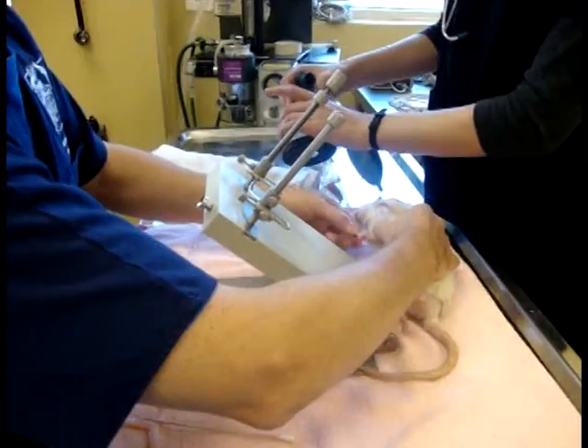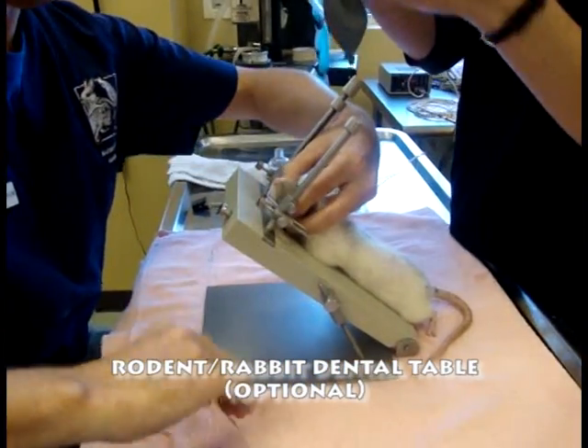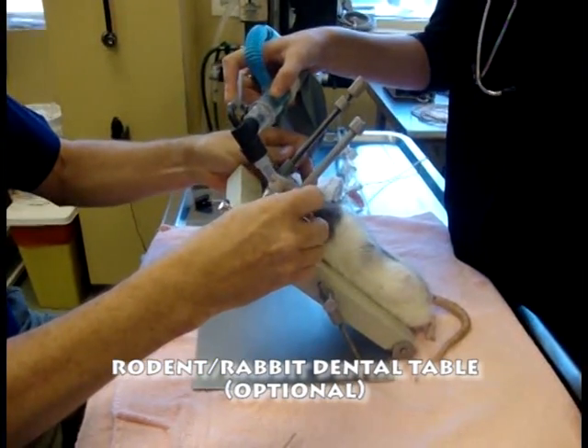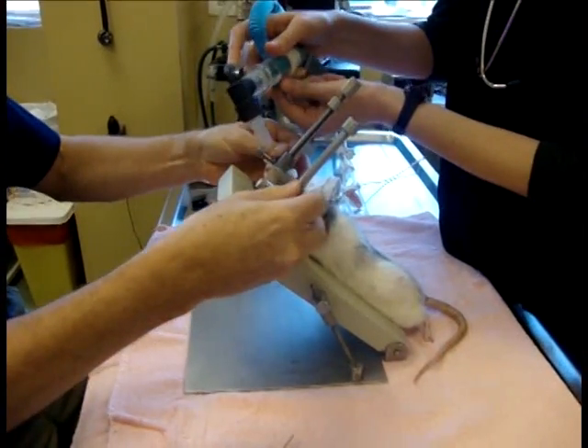For this demonstration I will be using a rodent rabbit dental table to intubate. It will help free up my hands for the procedure. It's not mandatory for doing intubations of small rodents, but it will help in certain situations.